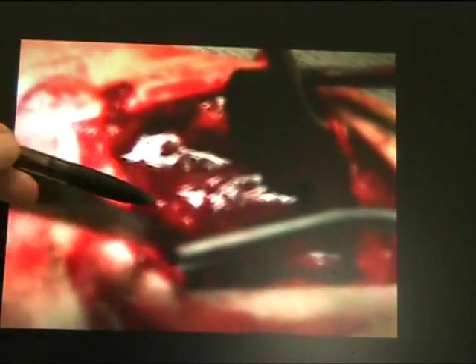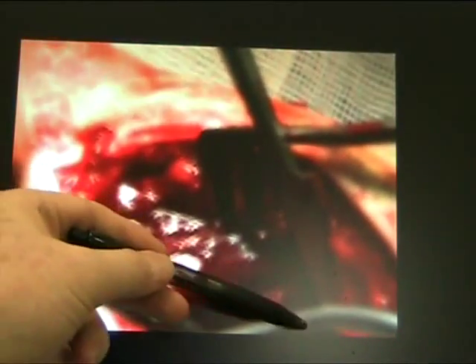Here we see the pronator quadratus has been lifted, and the displaced fragments are ready to be reduced.